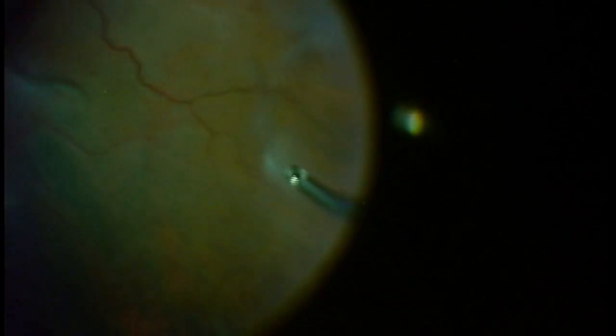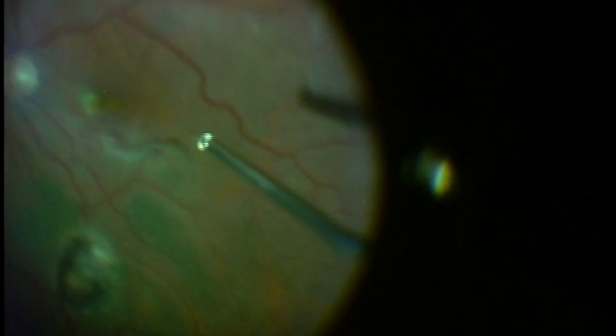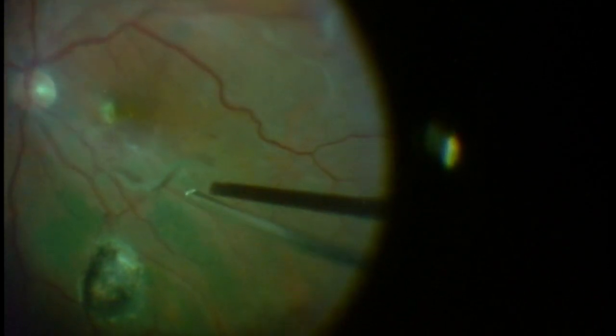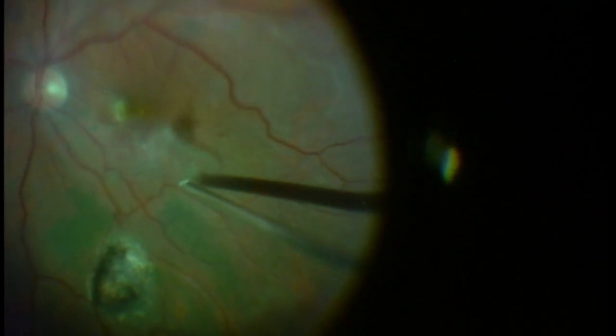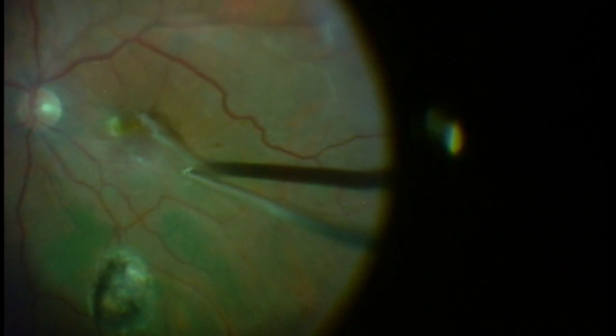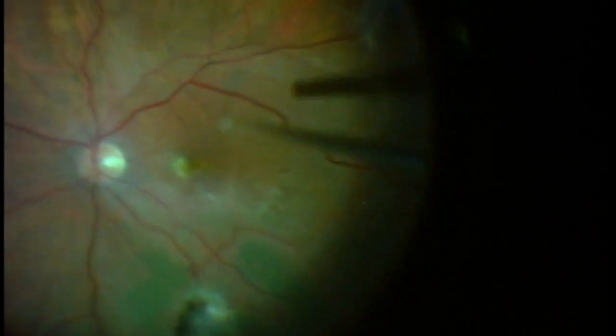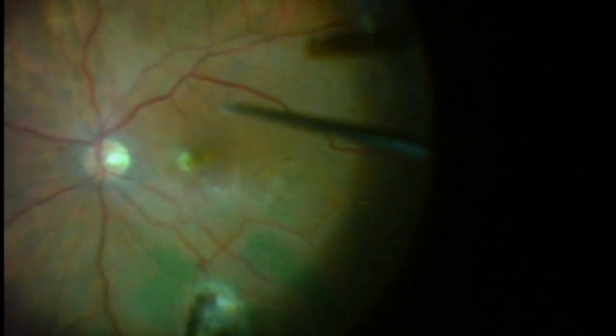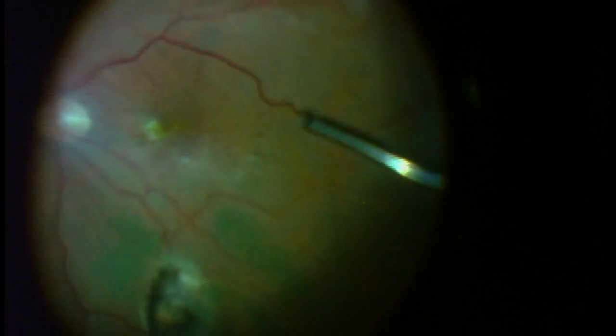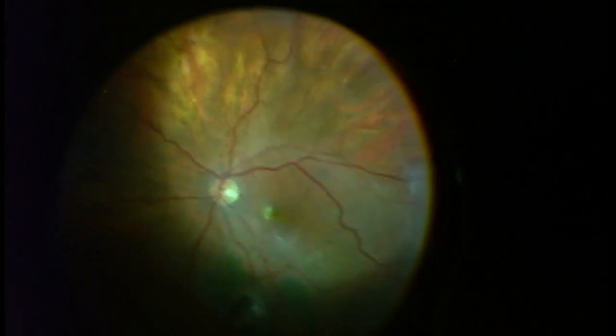There's some peripheral scar tissue far away from the macula. We're going to leave that alone. What I'm going to do here is just remove or cut this epiretinal tissue, which is still attached to that little piece of retina. The whole idea is to make the macula as normal as possible, because this will translate into improved vision, we hope.